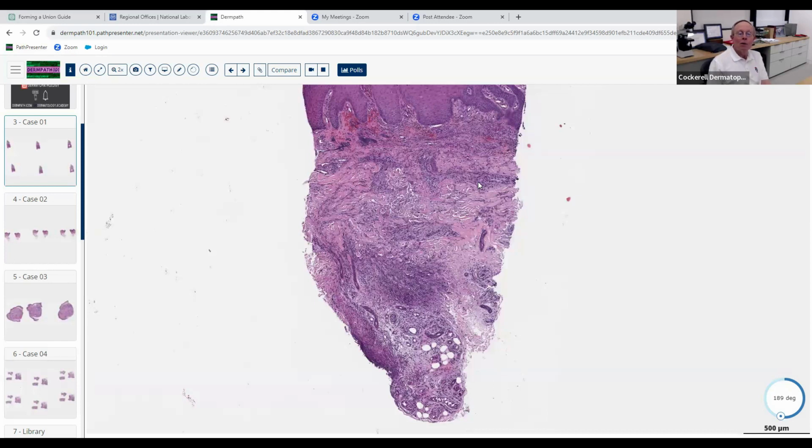Very good. So if they look a little bit dark, but they're not jet black, what do you think the cells might be? Maybe neutrophils. Yeah, good. And so what's the pattern of the inflammation that we're looking at here? It is diffuse, but it's not covering everything, is it? It's not wiping out all of it. Groups, maybe nodular, a little bit nodular over here. Yeah. Got some inflammation here, and then some sparing of some of the collagen, then maybe it picks up over here again.